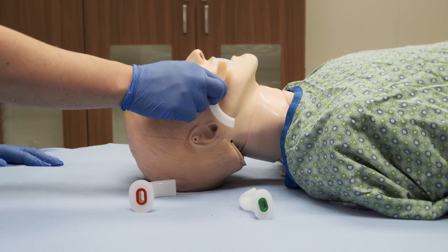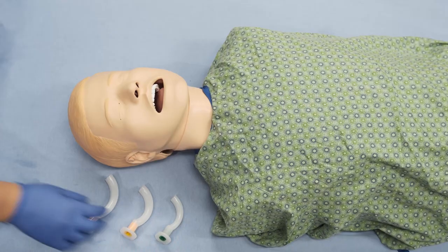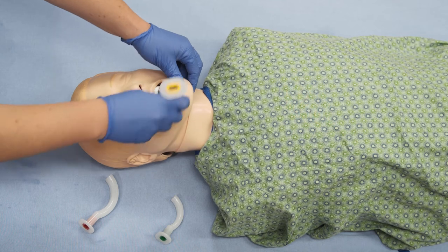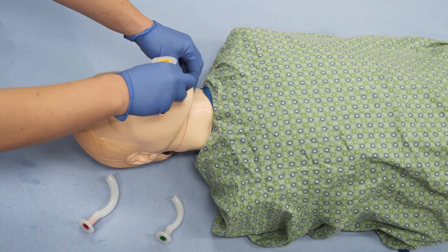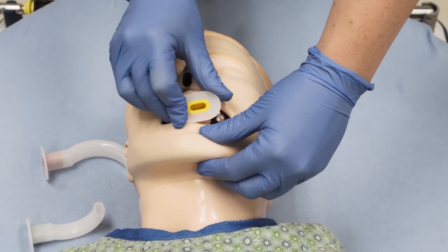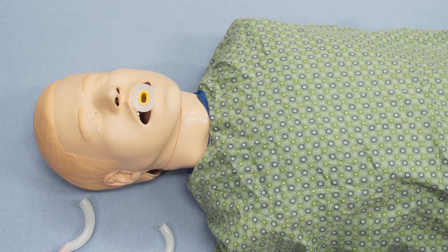Open the person's mouth using care not to insert your fingers between the teeth to avoid accidentally being bitten. Insert the OPA with the curved portion sideways and the tip pointing towards the cheek. Push the OPA gently into the mouth and when you can push no further, rotate the OPA 90 degrees so that the tip now points down the throat and follows the curve of the tongue.